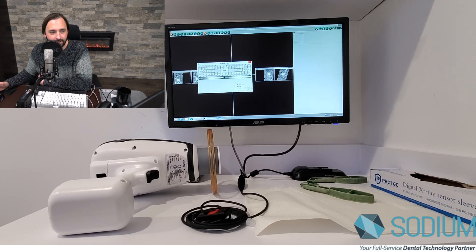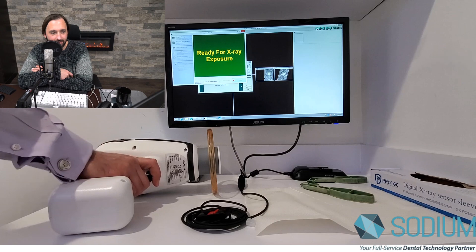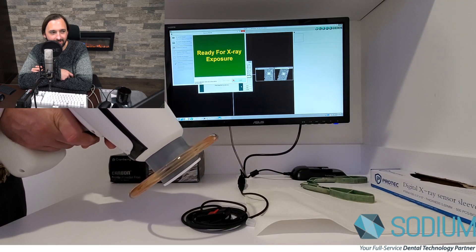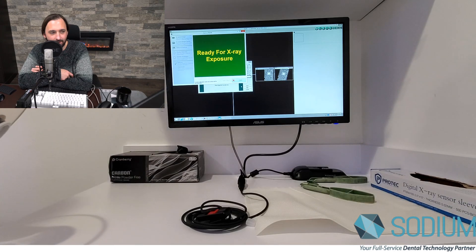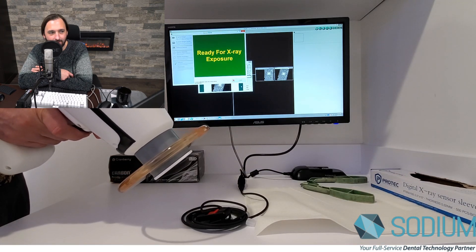I'm going to go ahead and click to capture a series, just like you would in Dexus. It's going to pop up ready for exposure. This is a test sensor — we're going to go ahead and just x-ray a key fob. It's going to pop up right away and go back into TWAIN mode.